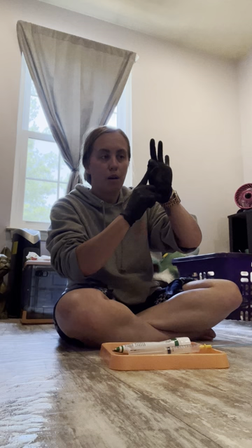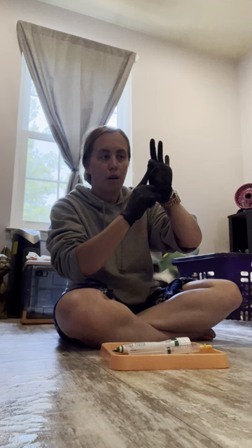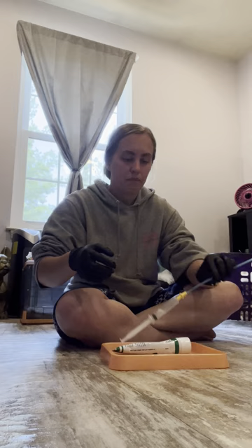Let's turn the whole thing this way. You put your finger up to the top, through. There's a bean in there — it feels like a jelly bean — and you push down. Then, once you're pushed down, you run the pipette over your finger and through. It'll come to a brief stop. Push through and then a second stop. Pull back just a little bit and plunge. If the dog's open, it might not even have a first stop.